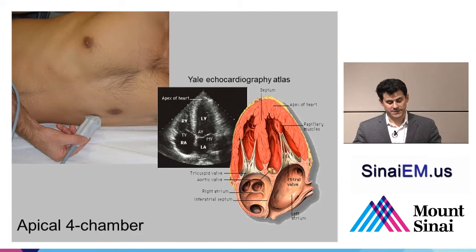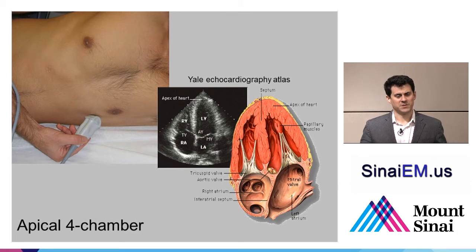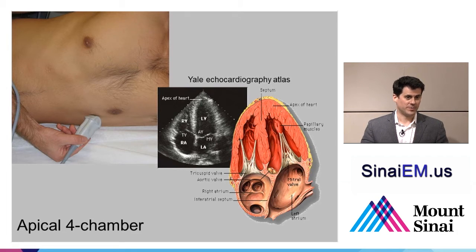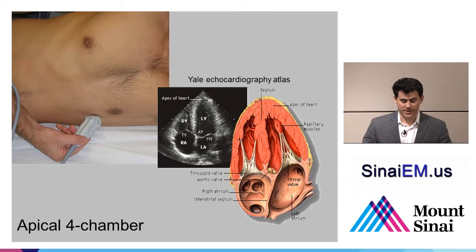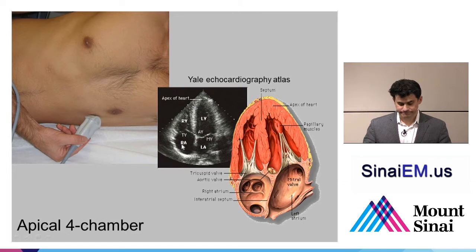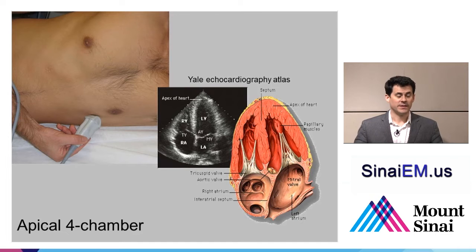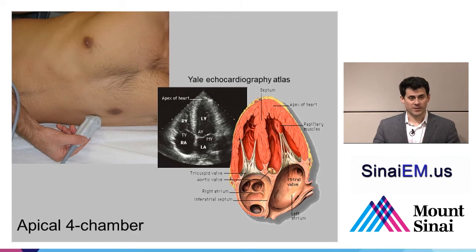Another very commonly used view is the apical four-chamber view. The probe is held at the patient's point of maximal impulse. With all cardiac ultrasound, the patient's position is best when laying in a left lateral decubitus position — this pulls the lung away from the heart, allows the heart to press against the chest wall, and minimizes interference while maximizing the view. The apical four-chamber view is sometimes incredibly challenging without getting the patient into a lateral decubitus position. This view shows the left ventricle towards the right-hand side, the right ventricle next to it, and the atria at the bottom of the screen.